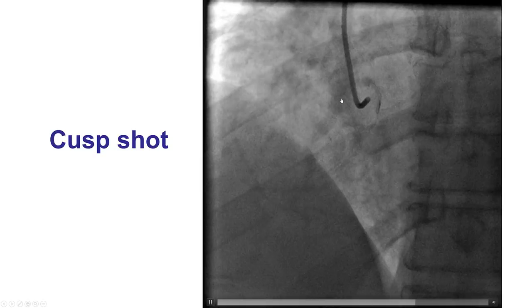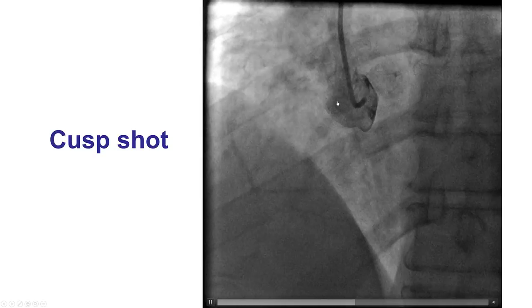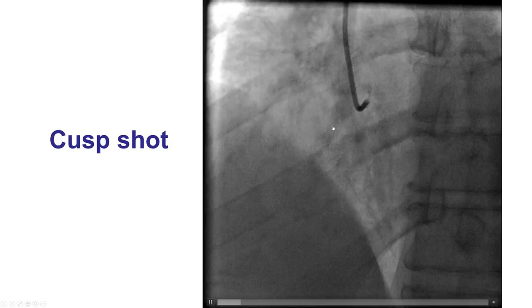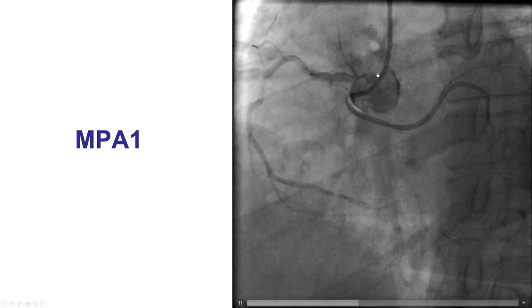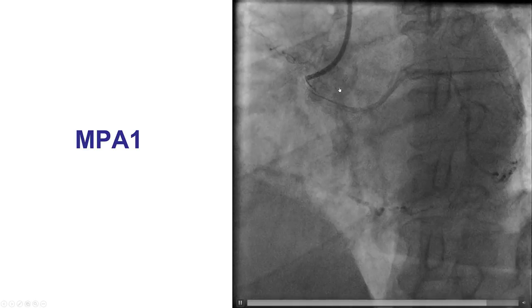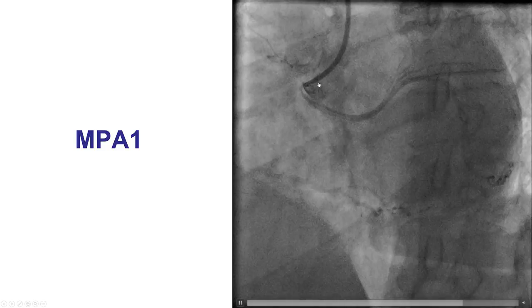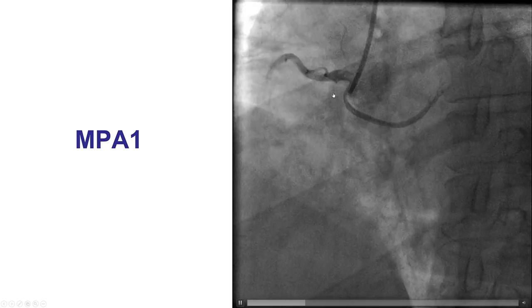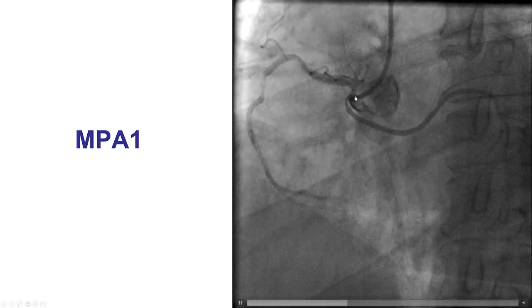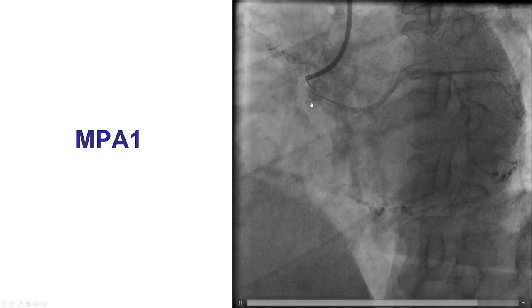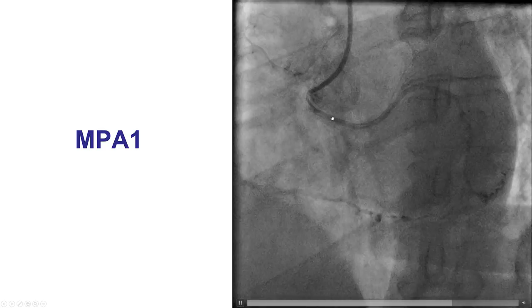So we did a non-selective injection on the right sinus of Valsalva, and that does demonstrate a vessel coming off which is likely an anomalous circumflex. Using a multipurpose catheter, we were able to see that there is an anomalous circumflex originating from the right sinus of Valsalva below the origin of the right coronary artery. Not only that, but it seems to have a high-grade lesion in the proximal segment, which seemed to be the reason why we had difficulty engaging the vessel.